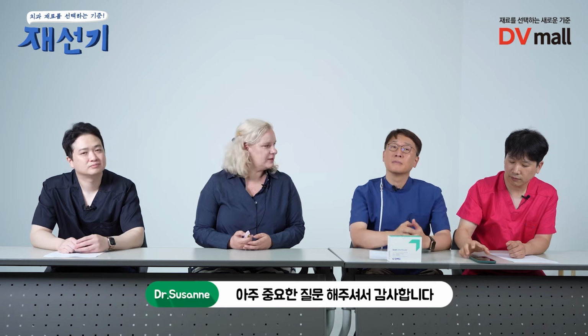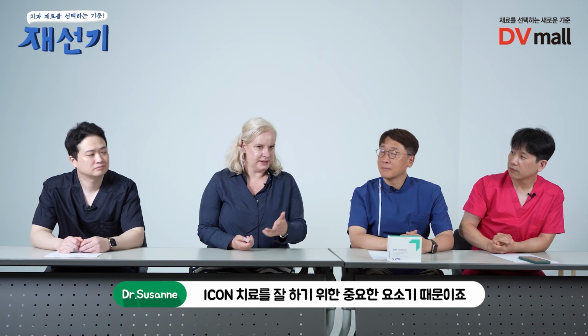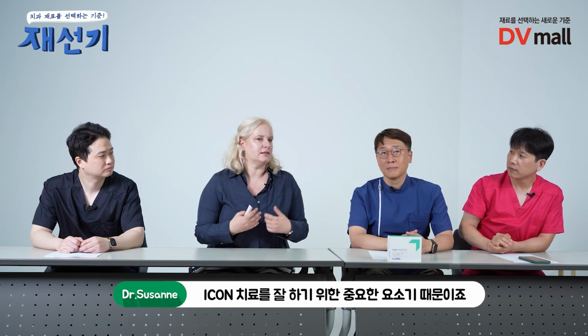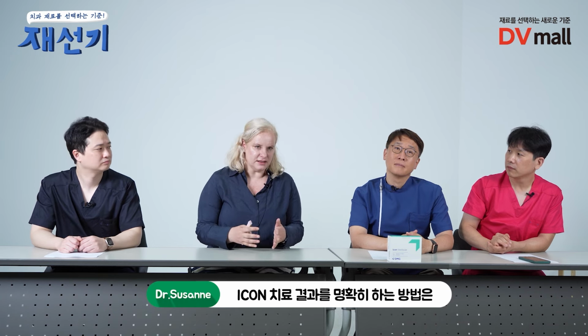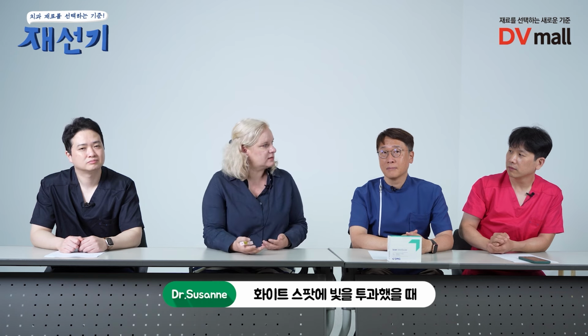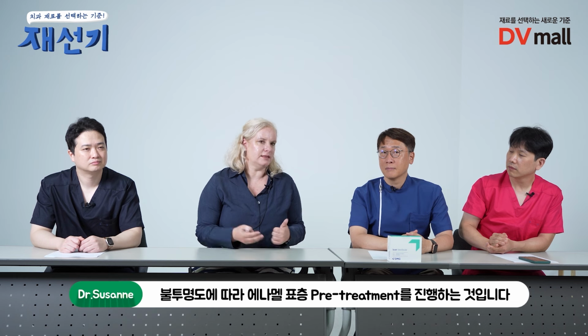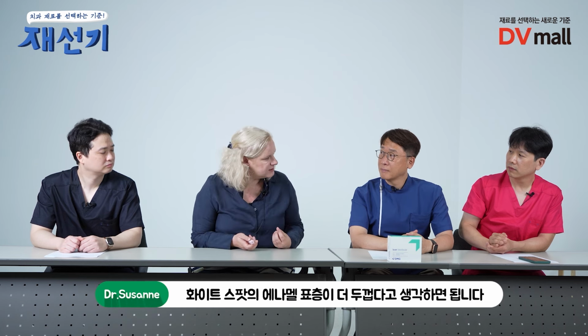Yeah, that's a very important question. Thank you for this one, because this is something we are currently working on also in clinical trials to really get a good outcome prediction, because I think that's the biggest challenge for dentists that are starting to use this technique. There is a certain classification depending on the opacity of the lesion during the transillumination process, and as a rule of thumb, I would say the darker or the opaquer the lesion appears, the thicker the surface layer is.